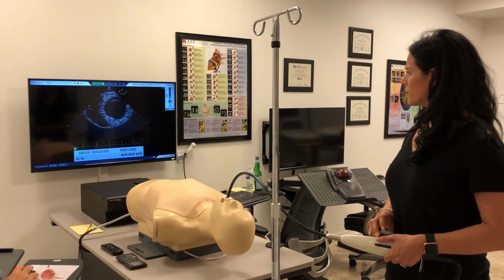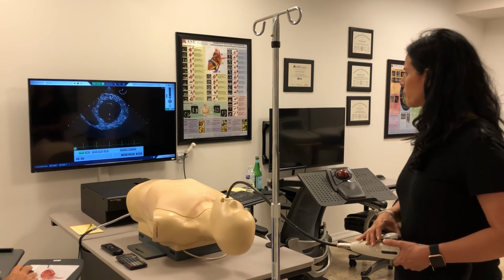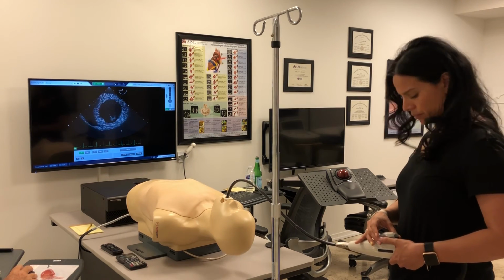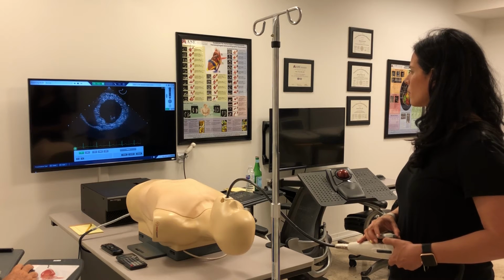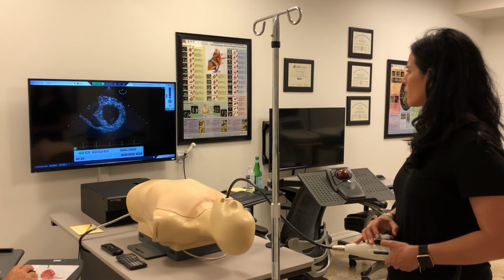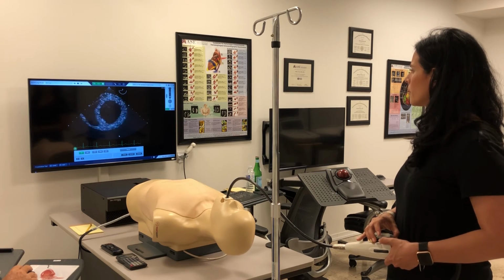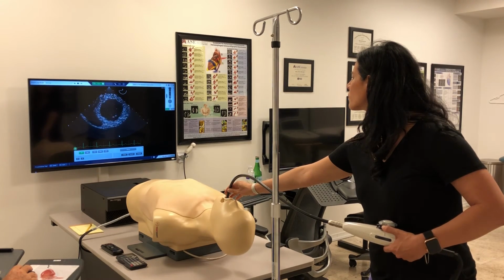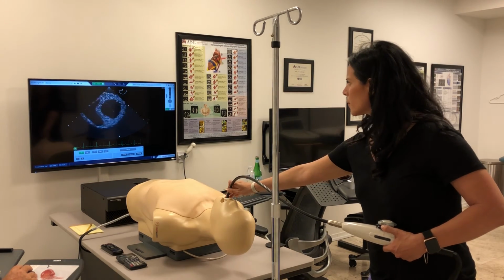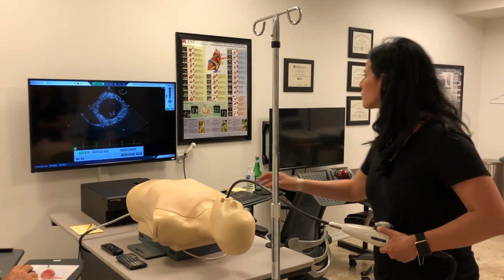This image is a little bit oblique, because in the far field you're seeing papillary muscles here, and in the near field you're kind of at the right level. So let's introduce a little bit more anteflexion. Now at the same time, please recognize that you're seeing coronary sinus. So that means that you're still in the esophagus and you need to introduce the probe a couple of centimeters further with some pushing of the probe at the bite block. A little bit further till you really lose that coronary sinus. Good. Now you're in the stomach.